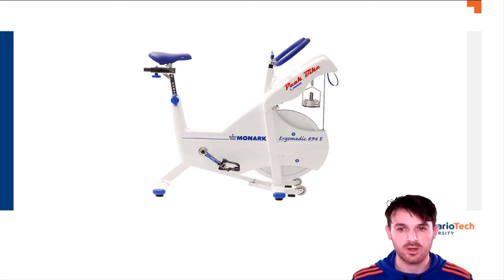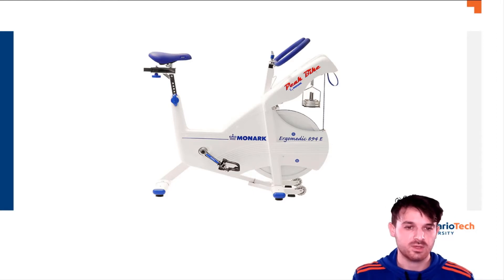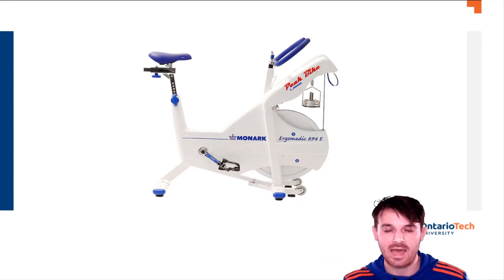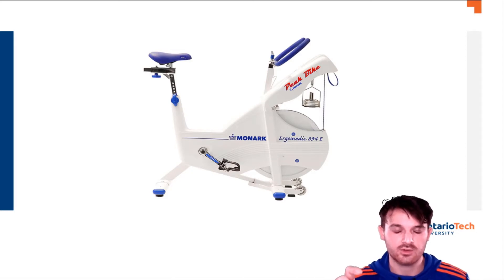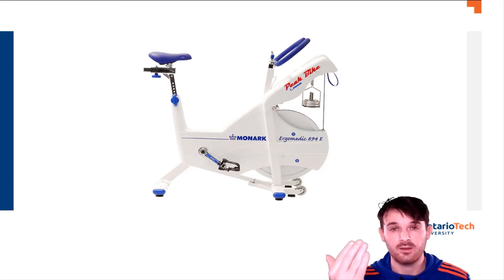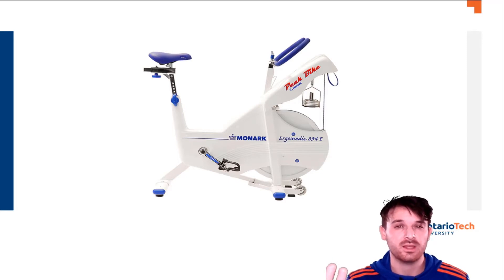This test typically takes place on the Monark Peak bike, the 894E. It's a fairly typical cycle ergometer with a heavy 6-kilogram flywheel and a basket where you place circular weights ranging from 1 kilo, half kilo, or 0.1 kilos. The basket is suspended via a small electromagnet, and with the press of a switch on the handlebars, the weight drops down applying the entire load at once. The prescribed load for Wingate is typically 7.5% body weight, though it can go up to 9 or 10% for athletic populations.